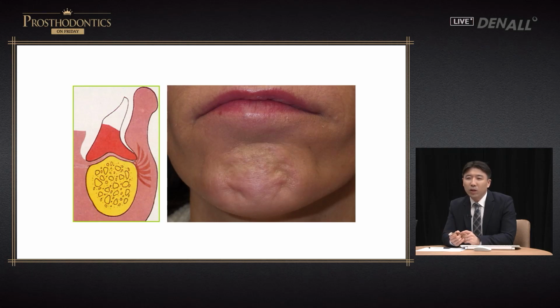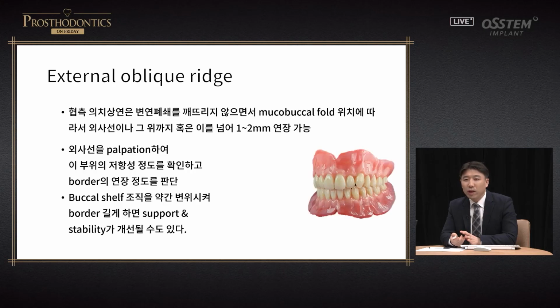In order to close his or her mouth, the patient really uses this muscle. When we take an impression and put in the tray, it is pushed forward. You can frequently see a highly activated mentalis muscle. Making sure that this is not too activated when the impression is taken is very important.